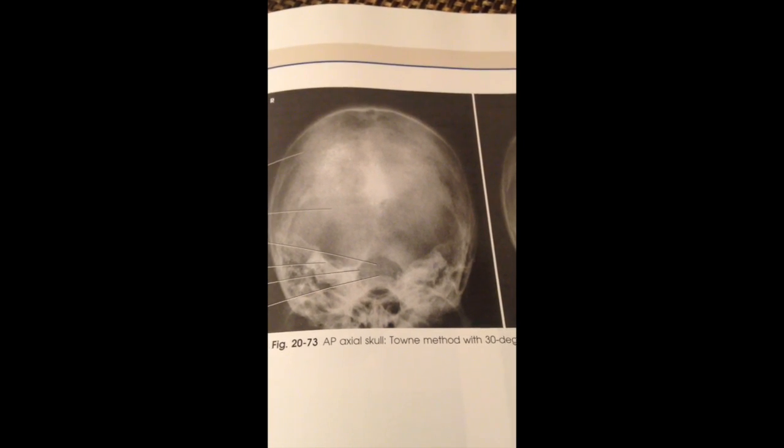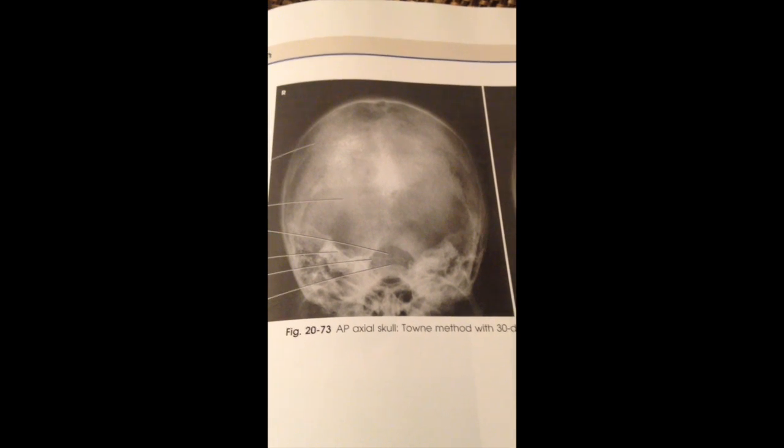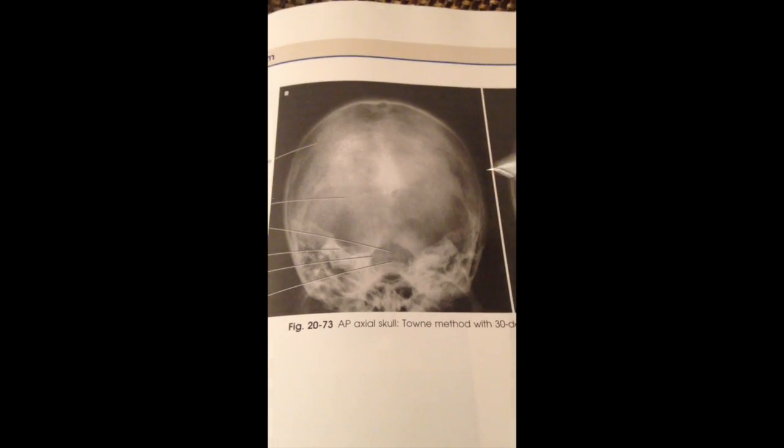The mid-sagittal plane of the cranium is aligned with the long axis of the collimated field, and it also shows penetration of occipital bone with appropriate brightness at the lateral borders.